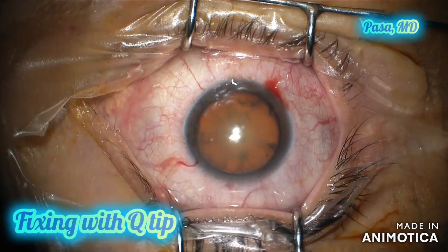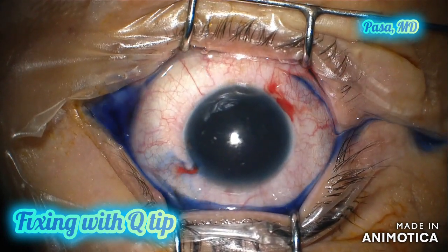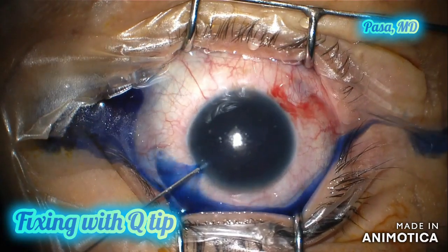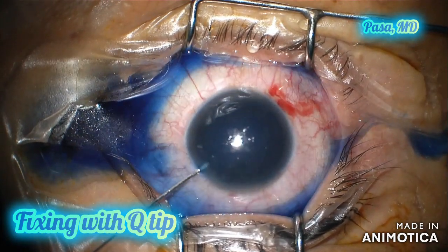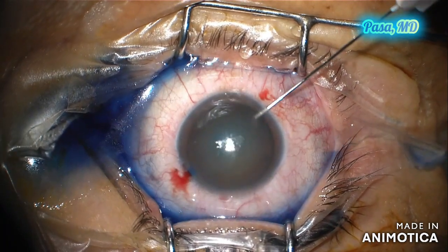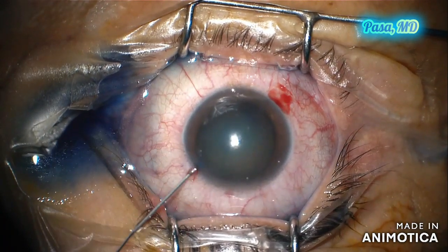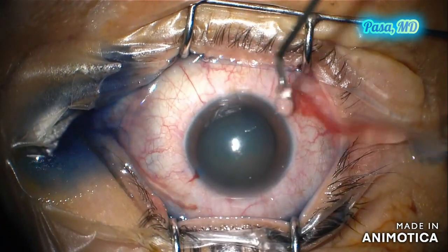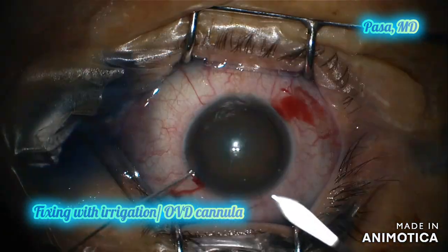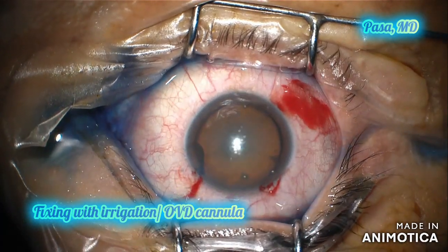There are multiple ways to fixate the globe. Here the nurses are applying topical anesthesia, and I'm injecting Vision Blue and an intracameral anesthetic agent into the AC. For topical cases, you really have to find someone who doesn't have a language barrier with you — someone very cooperative, that you trust won't move around. Remember, once two instruments are inside the globe, the patient cannot really move.